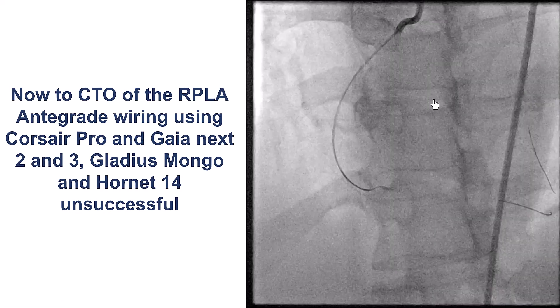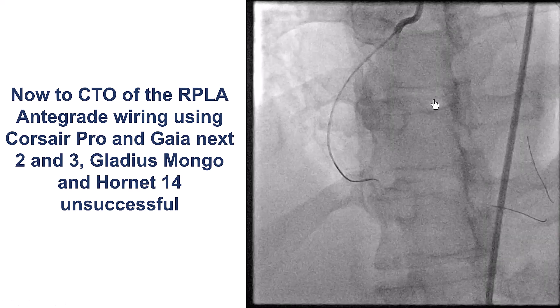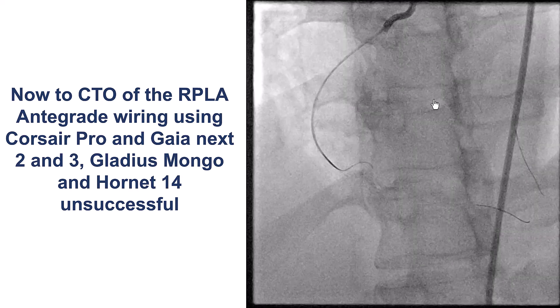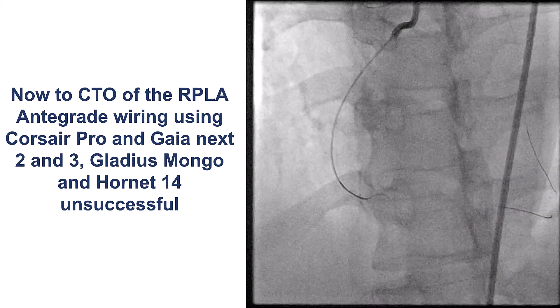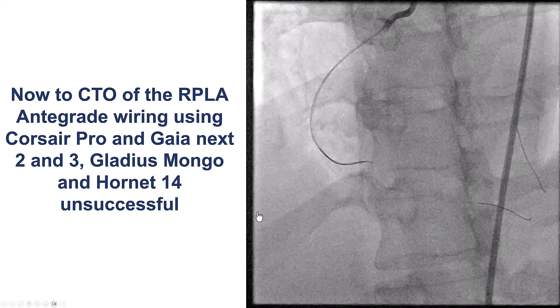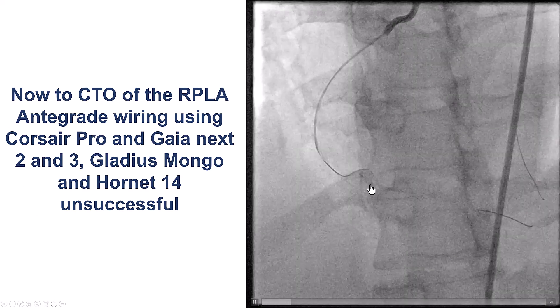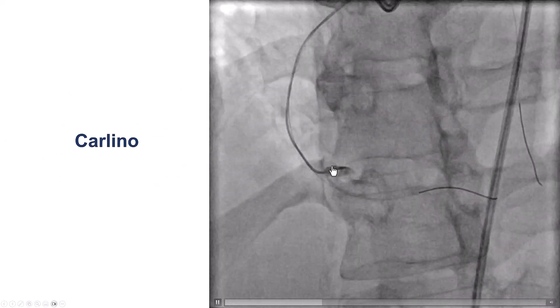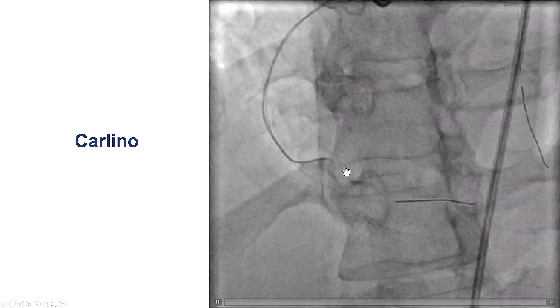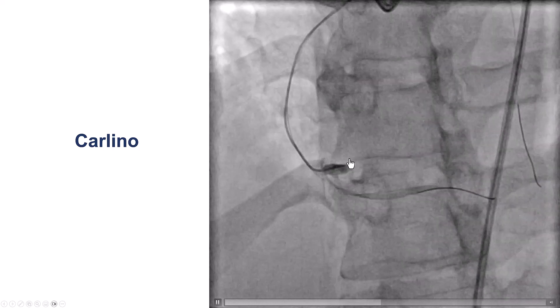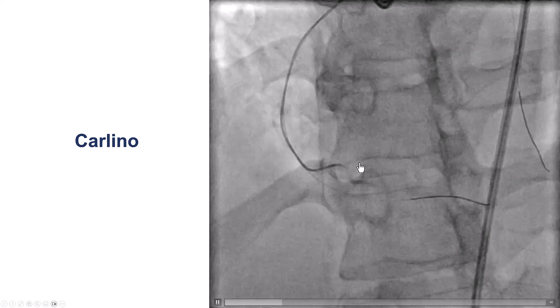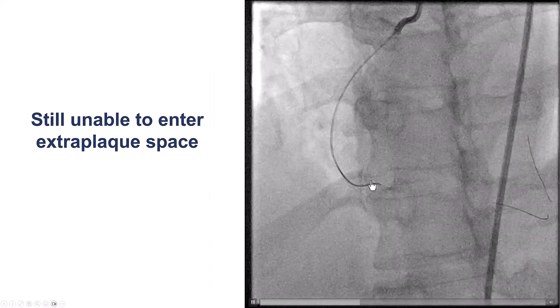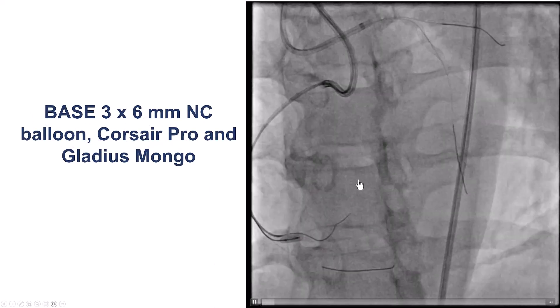At this point we debated proceeding with the CTO, but we had dual access, the patient was doing fine, and radiation and contrast dose were not high, so we decided to go ahead. We placed a Corsair and used multiple guide wires in an attempt to cross the proximal cap but were unsuccessful. We tried the Carlino technique — injecting contrast — but it was a blunt cap and we could not make any penetration into the area of the occlusion. We also tried to get into the extraplaque space but could not.